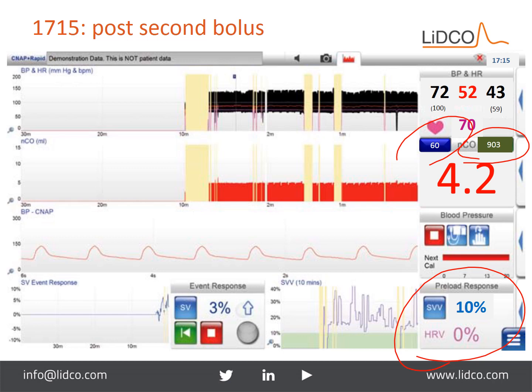One thing that's really important for this stroke volume variation measurement to be valid is that your patient needs to have the following criteria. They do need to be intubated. They need to have a closed chest with an intact diaphragm. They need to be on a positive pressure ventilatory mode of ideally 8 cc's per kilo, although some studies have shown validity with 6 cc's per kilo. They need to be riding the vent, in other words, not taking spontaneous breaths, and they need to have a regular heartbeat. So keeping that criteria in mind is very important if you're going to be depending on this measurement.